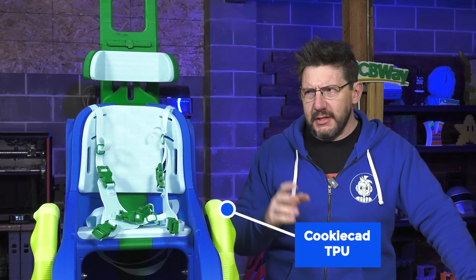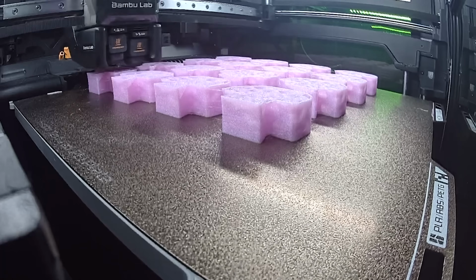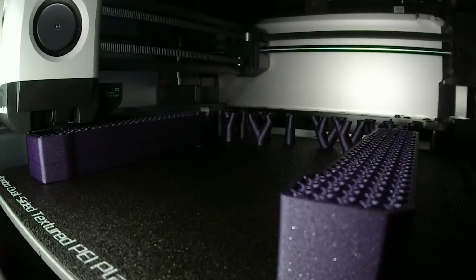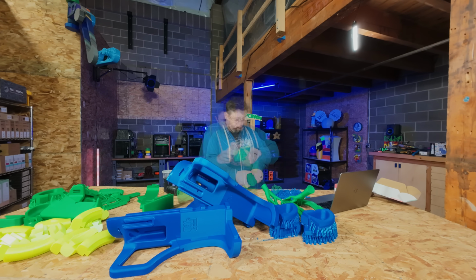The rigid pieces are made out of Protopasta's HTPLA, and the flexible parts are made using CookieCAD's TPU, which is a 95A, I believe. Everything printed on my Bambu Lab. Let's see, H2D, X1C, P2S. They worked overtime to get all these parts done, and then I assembled it right here on the desk.